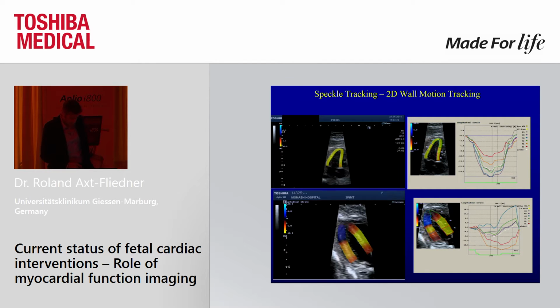And after that, this is done in a joint procedure with a pediatric cardiologist, Professor Schranz, who is a great interventionalist. And then we tried to occlude the stent as a possible model of hypoplastic left heart, because you know that there are no large animal models of hypoplastic left heart, and so we try to elaborate an animal model of hypoplastic left heart.